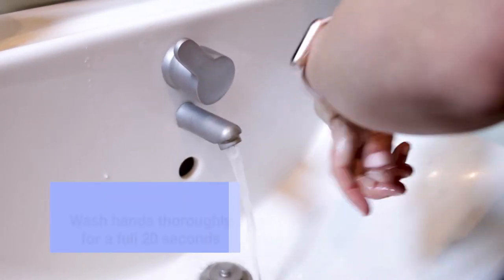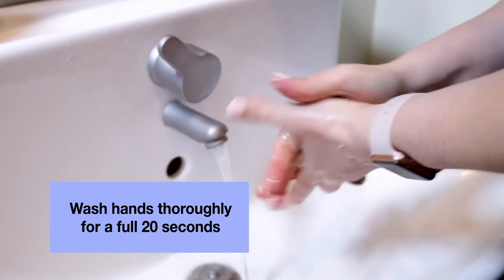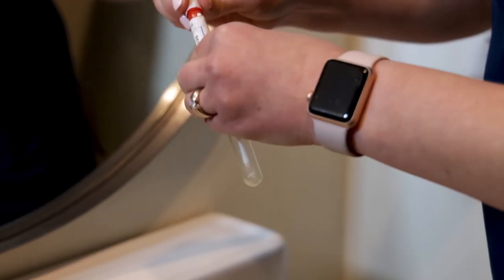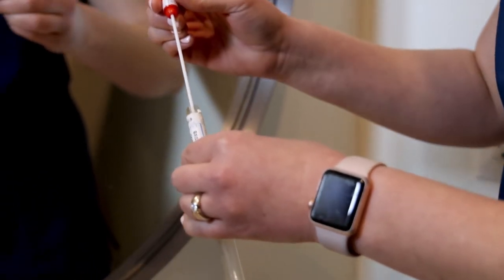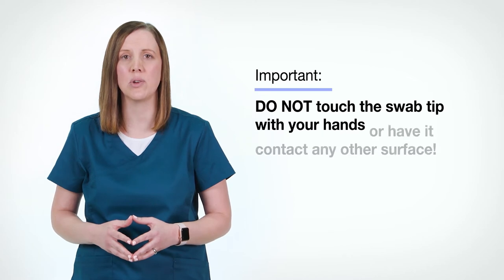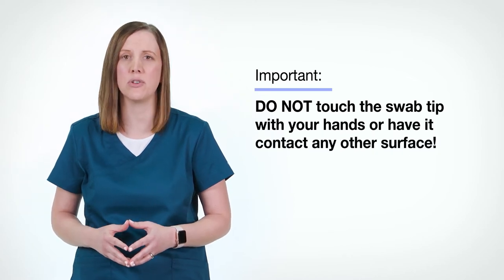Before we move to the next step, please wash your hands thoroughly with soap and water for a full 20 seconds. Once your hands are dry, remove the sterile swab from its container. It is very important that you do not touch the swab tip with your hands or have it come in contact with any other surface.